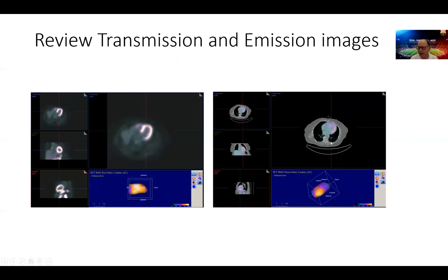This exercise again is meant to ensure the proper registration of the emission and transmission images before we start processing the images to avoid any artifacts of registration that can be misconstrued as defects.